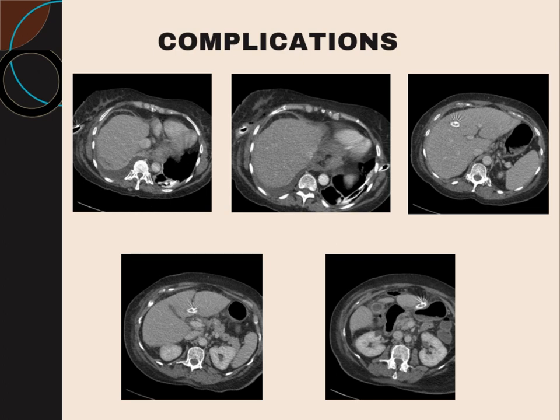In the third scan, it is coming into the liver, crossing over here. In the fourth scan, it is crossing the liver as well, and even entering into the abdominal cavity. So that is a complication if it develops at that point. Rather than giving some benefit to the patient, we are making things more complicated. It can lead to hemothorax, then hemoperitoneum as well, and traumatic liver injury will involve surgeons instead.